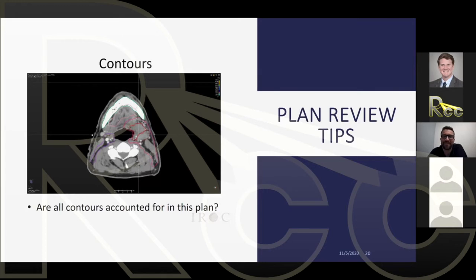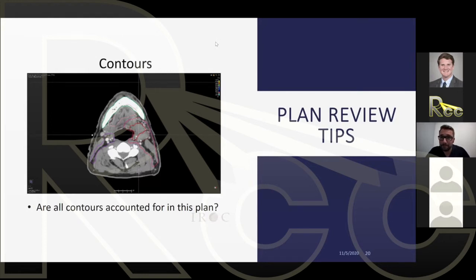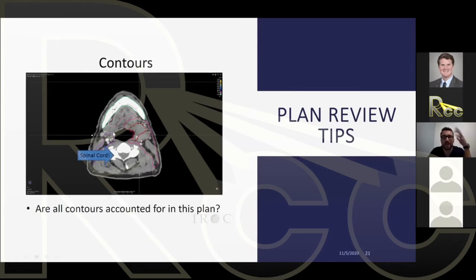What's missing in this next example? A participant answered correctly: the spinal cord. This is a head and neck case, so the spinal cord is the first thing you should make sure is contoured.